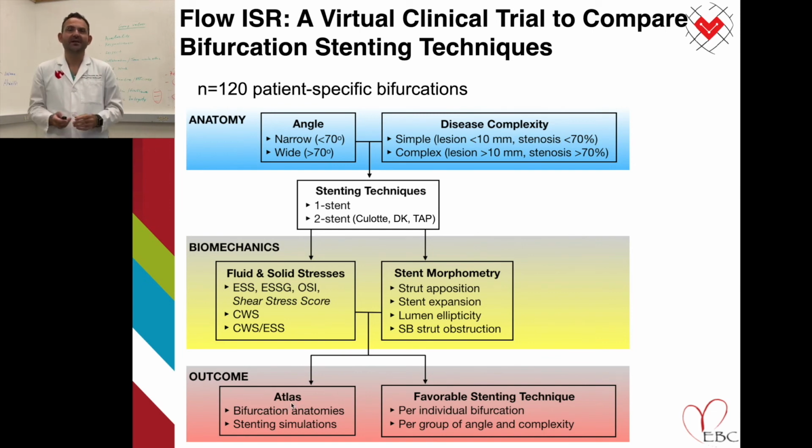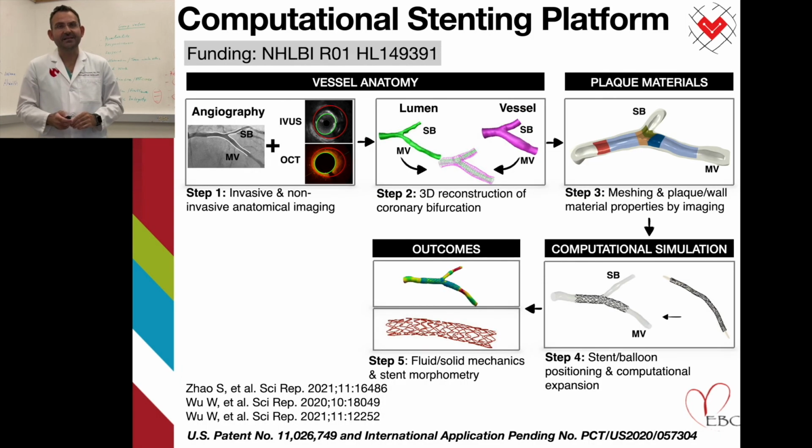The whole goal of this virtual clinical trial is to identify groups of bifurcations which are best treated with specific stenting techniques. Let me get into the specifics of this study.